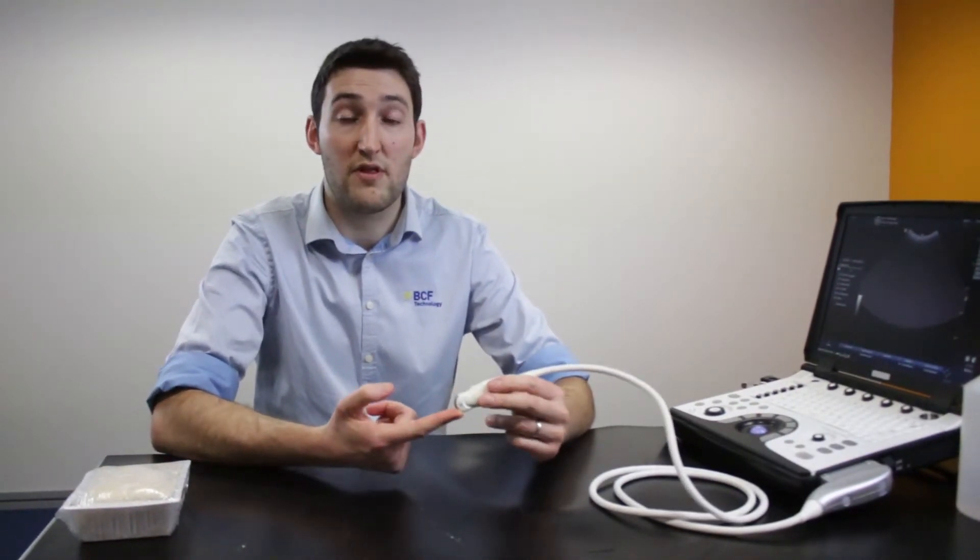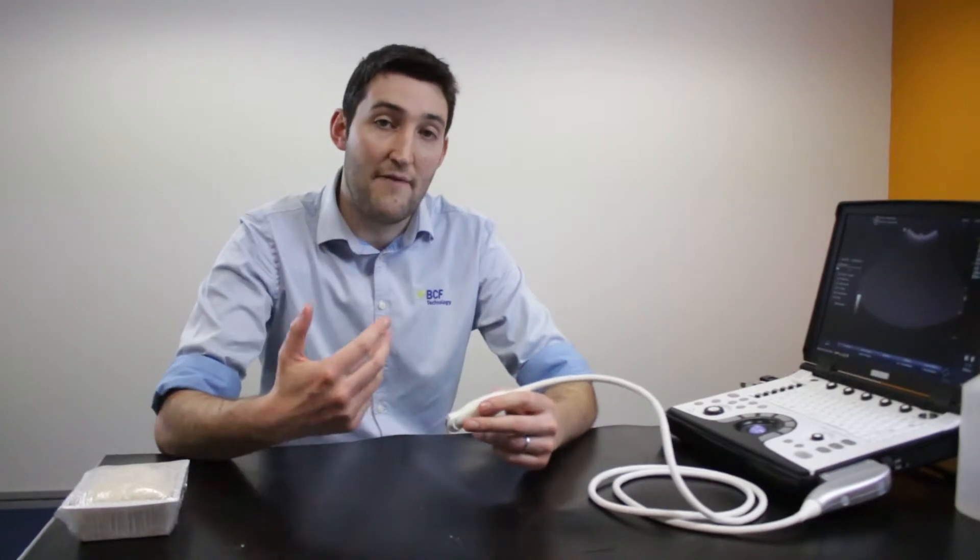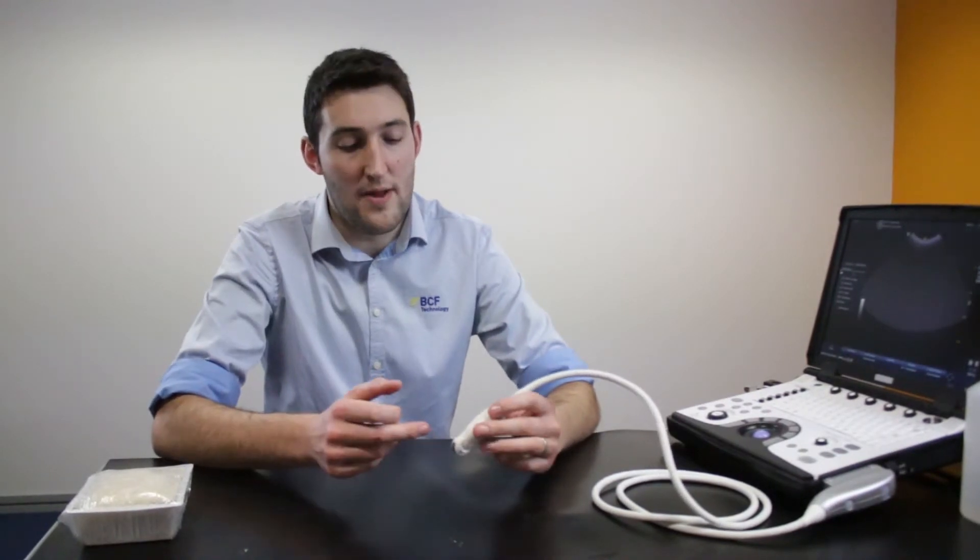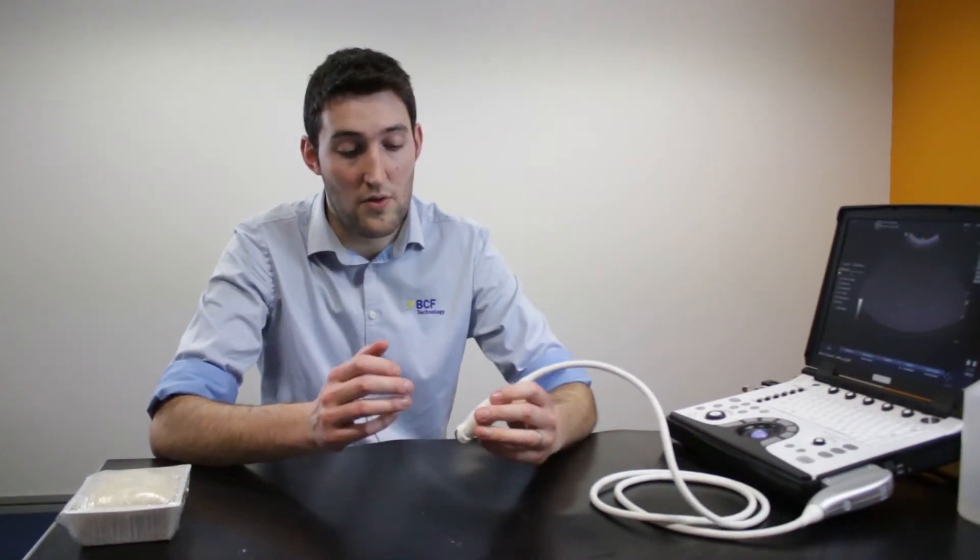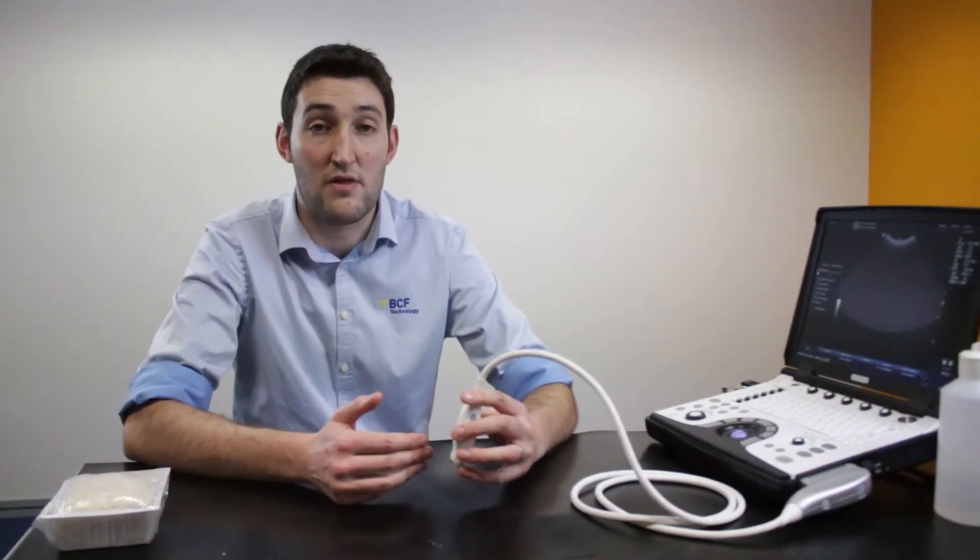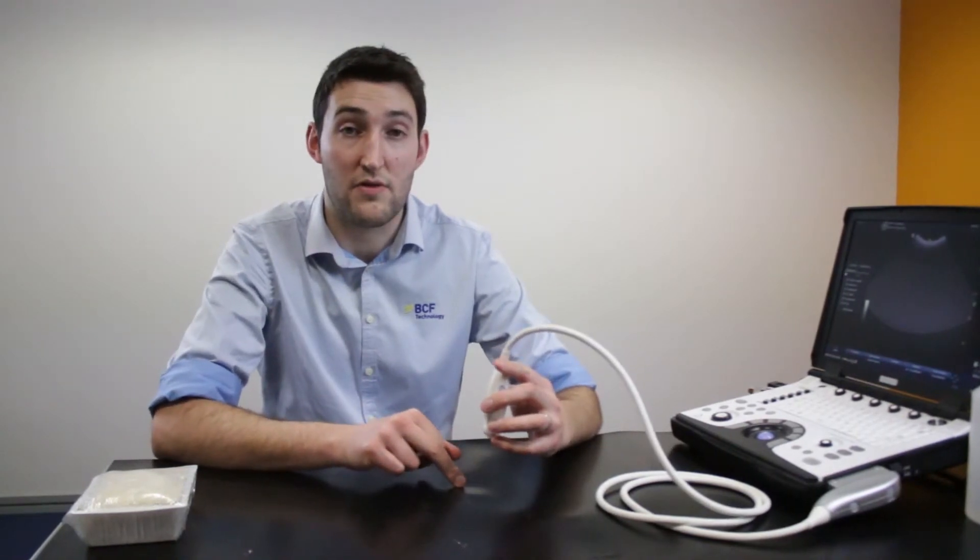Micro-convex probes also tend to be reasonably high frequency and for taking these samples we want really to be trying to get the frequency as high as we can. It's quite important to get the structure you're going to be sampling onto the screen, onto the image first. Optimize the settings of your machine to get the best image you can and again ensuring that the frequency is as high as possible while still enabling you to see deep enough to see the thing you want to sample.